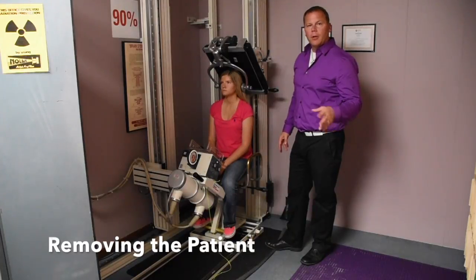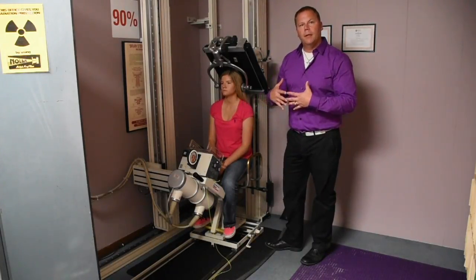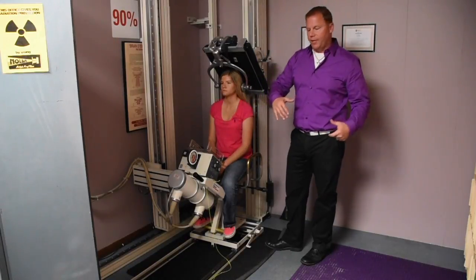When we're done with the base posterior, this is how the proper technique will be to safely move the patient out of the x-ray system.